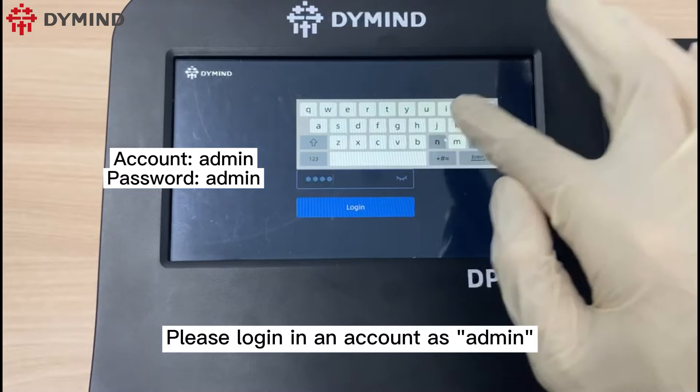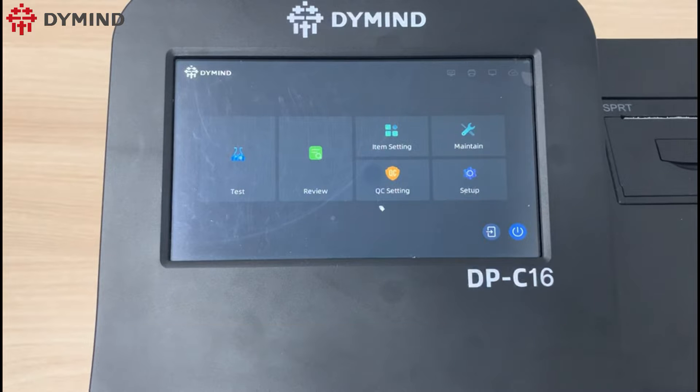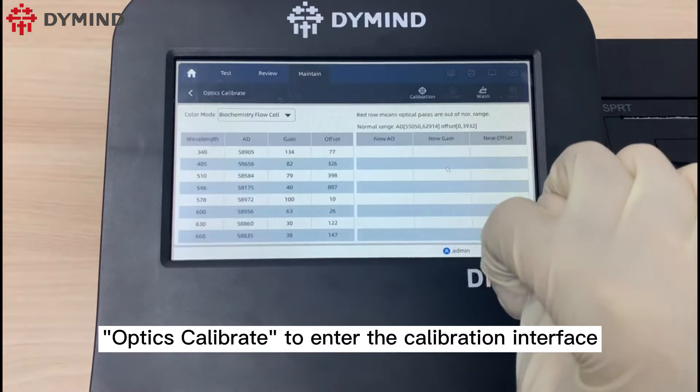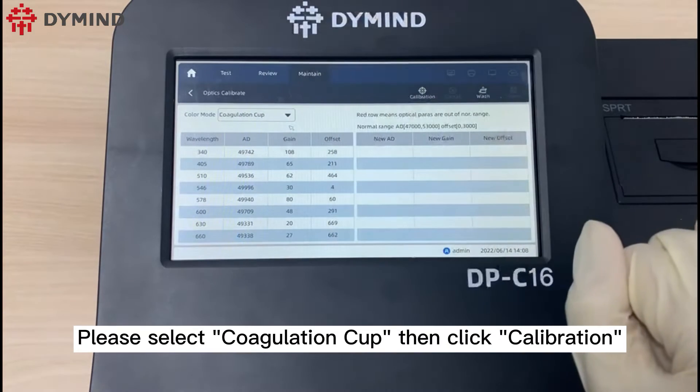Please log in with an account as admin, then click login to enter the main interface. Click maintenance, then optics calibrate to enter the calibration interface. Please select coagulation cup, then click calibration.